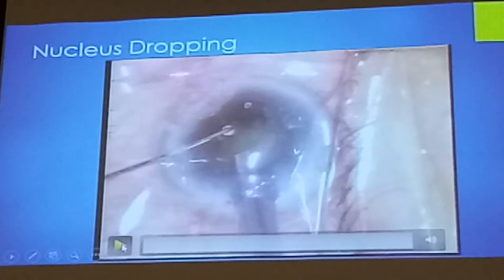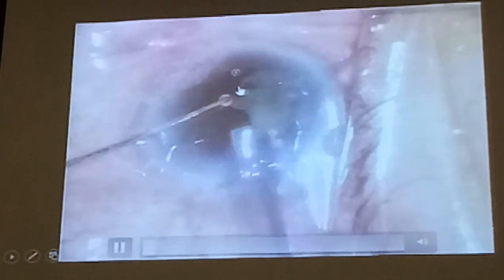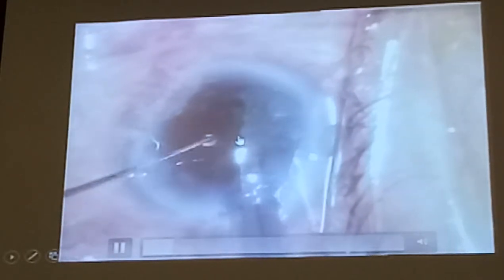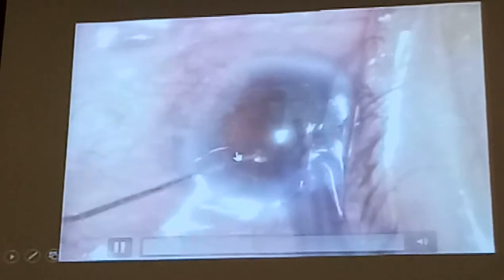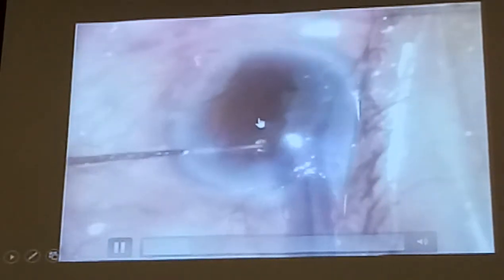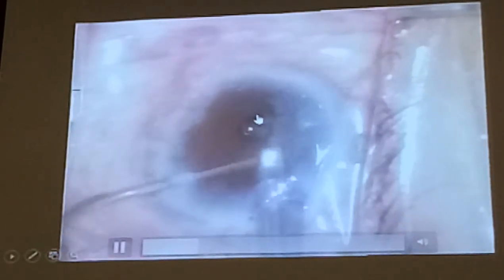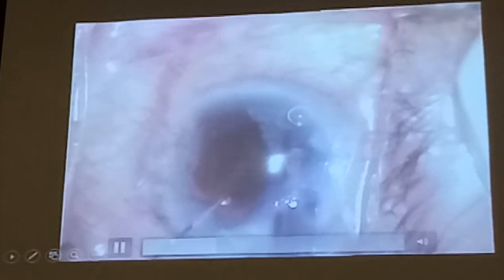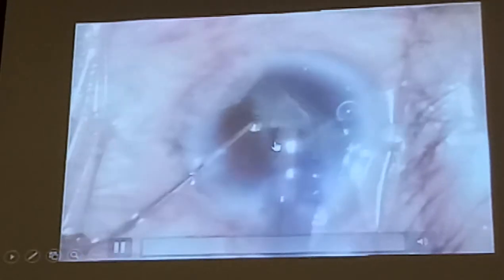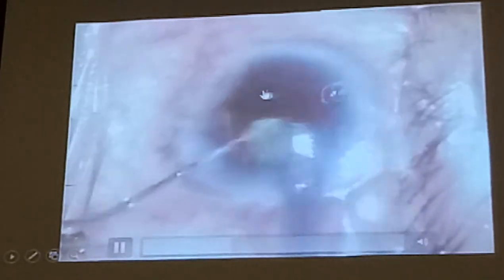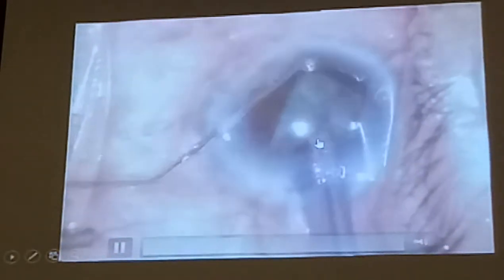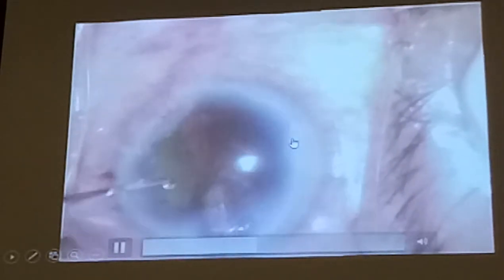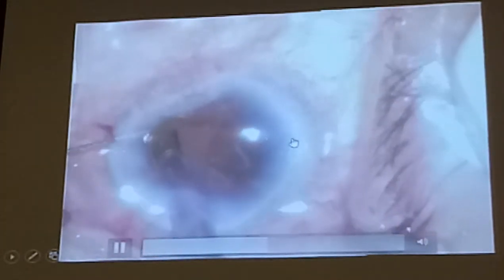Now this case — we saw the first part of this earlier showing the signs of PCR. This is late PCR already, when you have the fragment floating here and it gets caught with the vitreous. The vitreous may be invisible but you can see the signs. If you continue to phaco because you're catching more vitreous — you're sucking the vitreous — obviously it disrupts the rest of the posterior capsule here that's supporting the fragment. The fragment looks like it's disappearing but the surgeon is continuing. This is what you should not do. You have nothing here, just vitreous — don't continue to phaco.